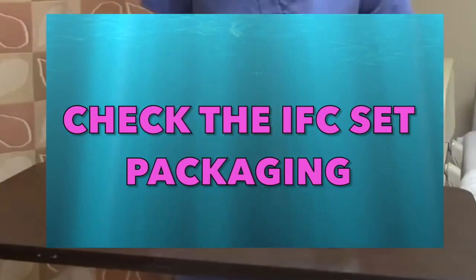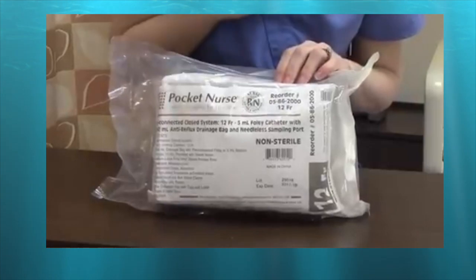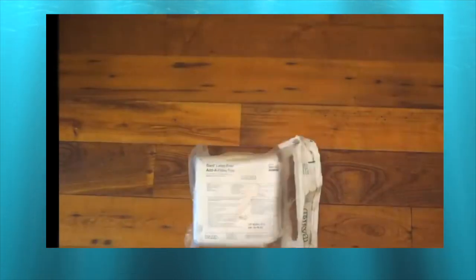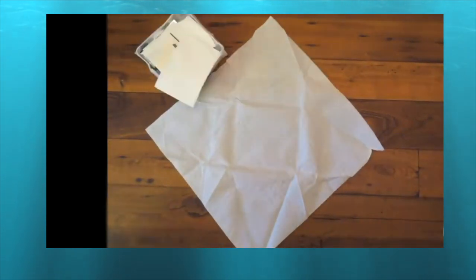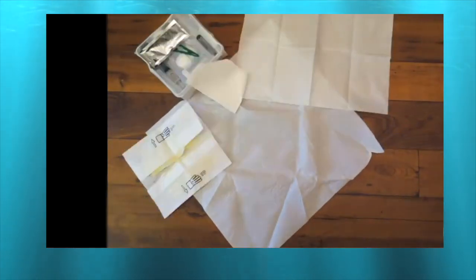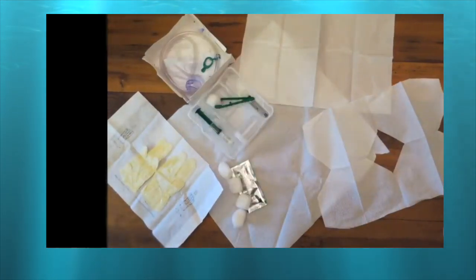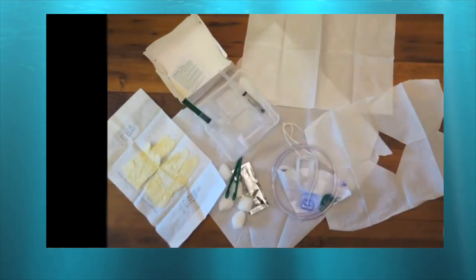Gather all the materials and check the foley catheter set packaging. Please note the expiration date and the validity of the set. Inside the packaging we have: the drape, the gloves, the fenestrated drape, betadine, cotton, tong, lubricating gel, saline, and the foley catheter set.